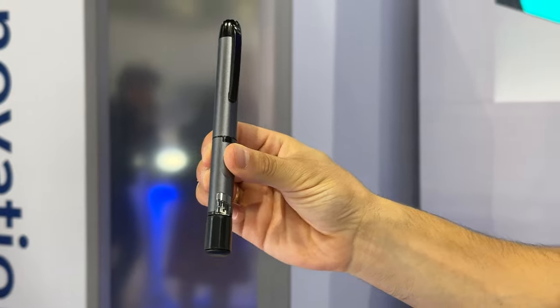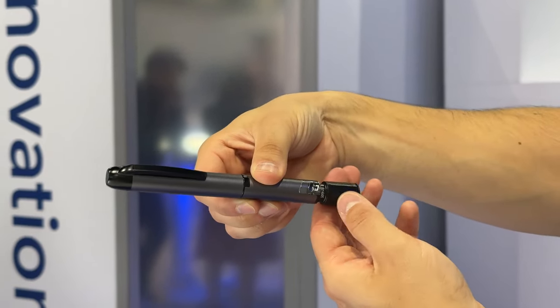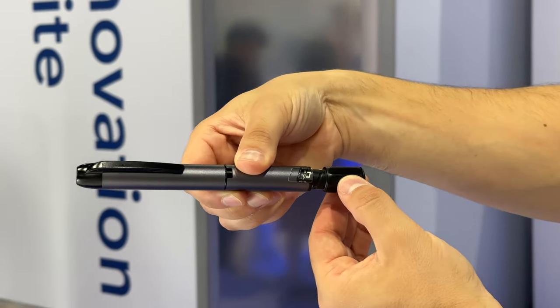I'm at the Medtronic booth to talk about this little thing - a smart insulin pen. Let's go ask some questions. I'm here with Madison from Medtronic and we're here to talk about InPen. I have used InPen - I used it when I did MDI and I really enjoyed my experience. Can you tell me a little bit about your experience with InPen?